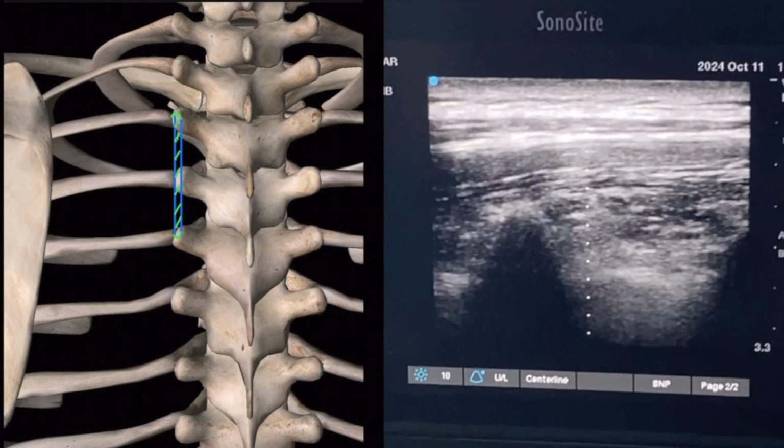After getting the costal view, you have to slide your probe toward the medial side, and when you reach the level of the costotransverse joint, you will see this sonoanatomy. Here you can see the step sign that represents the costotransverse joint with the acoustic shadow, and in between the two you can see the shimmering structure, that is the pleura. Here you can see skin, subcutaneous tissue, trapezius, rhomboid and erector spinae muscle.